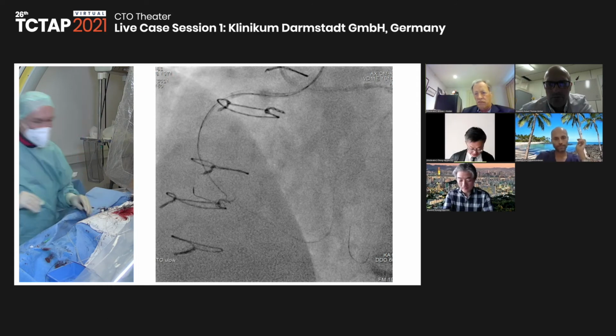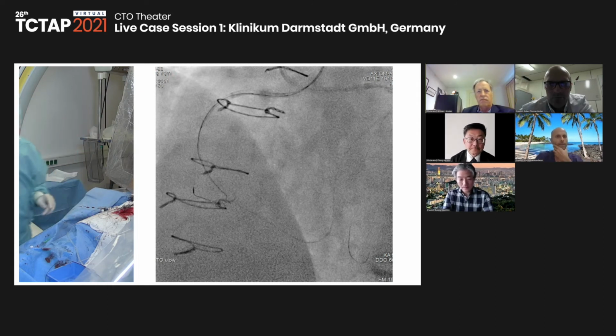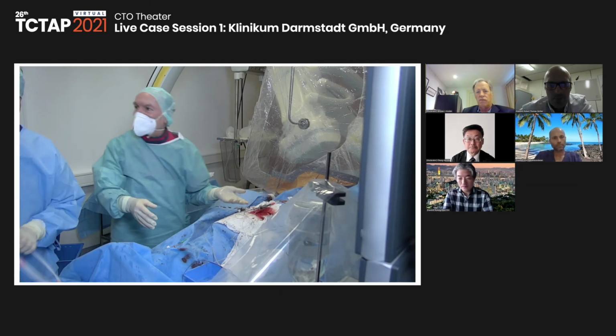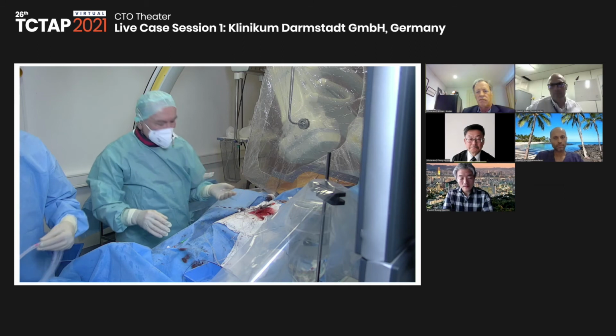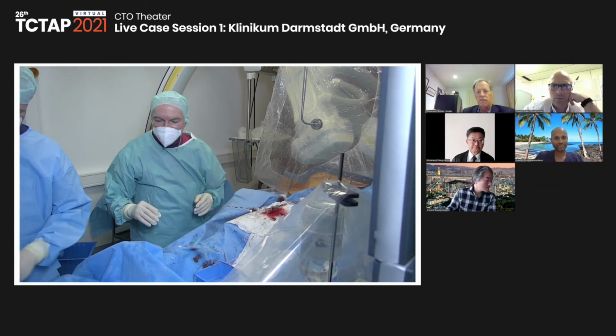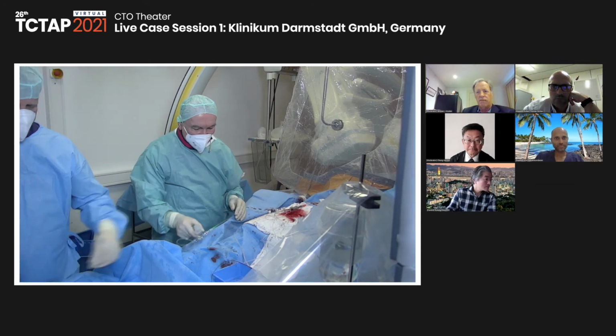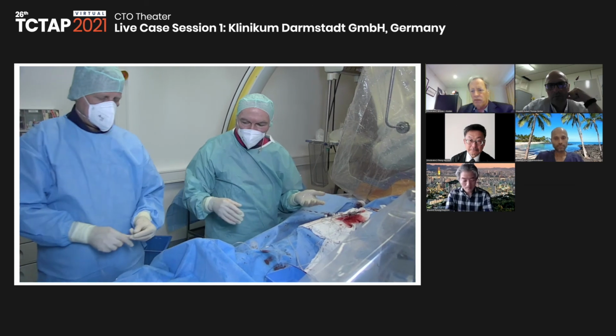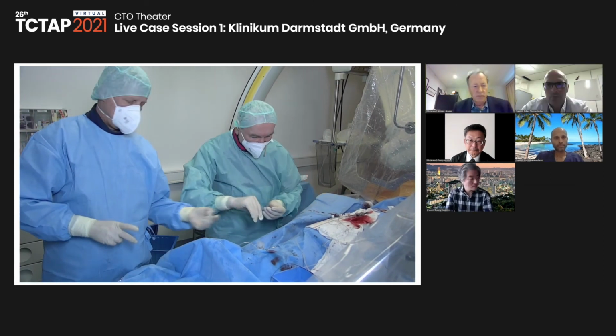Yes. Great. Beautiful. So I think now we have done the major thing, really, in 1 hour. It did look like there were septals in between, but maybe we can wrap up. Yeah. And I will continue, and then we show the final images with IVUS.